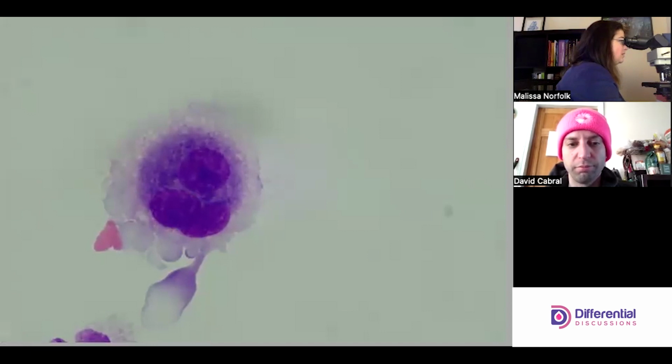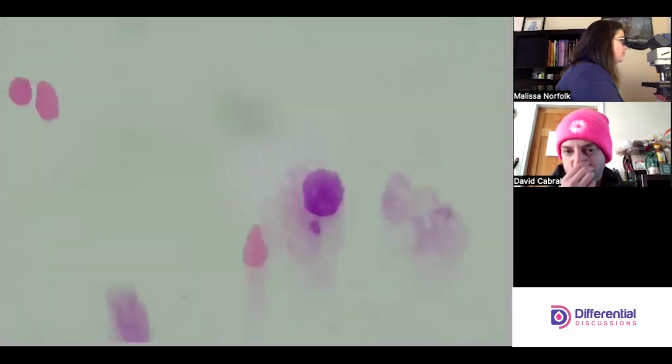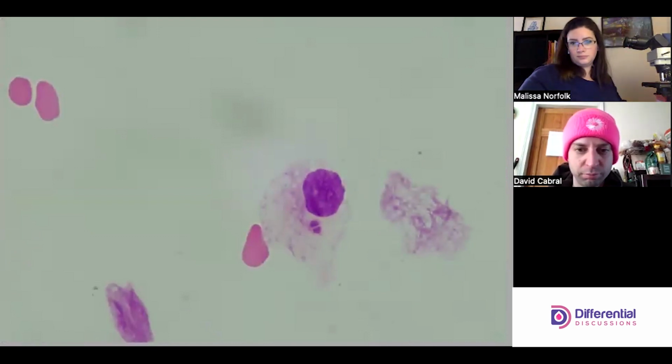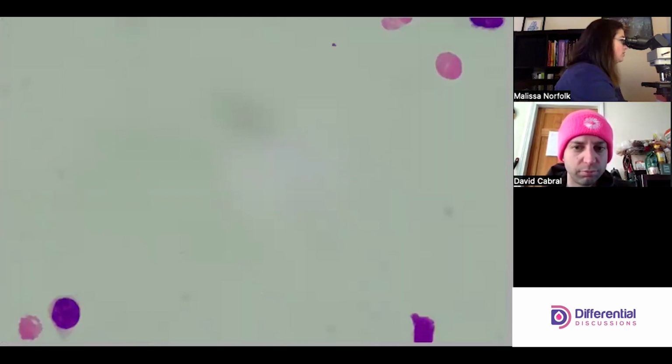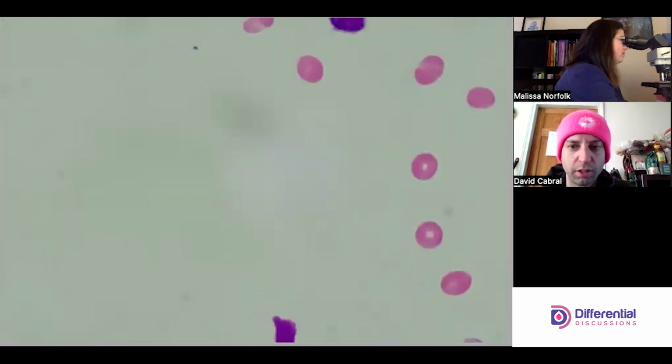Let's see what else we got here. Monomac. Wonder if that was something. We see some kind of an inclusion there, but tough to make out what it is. And macrophages are just really good at eating junk. Oh, not the direction. Let's go the other direction. Oh, here we go. Some more stuff.